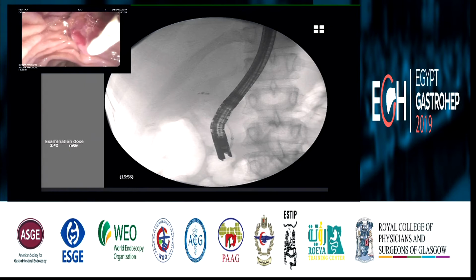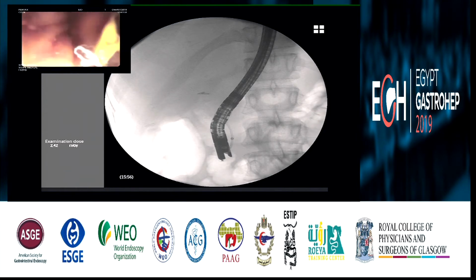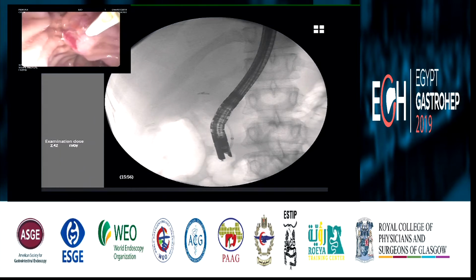You see, it should fly inside. If it stops, it's not good. Put a lot of water on your hand. I think there was minimal sphincterotomy done before. There was minimal papillotomy done before the previous procedure. Yes, it is done. You can see here. It's not very large, but it's okay, I think. Minimal, yeah. Limited.